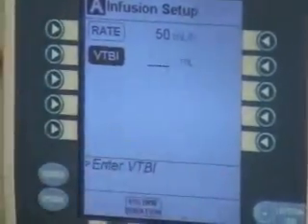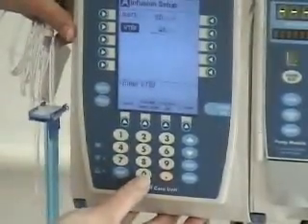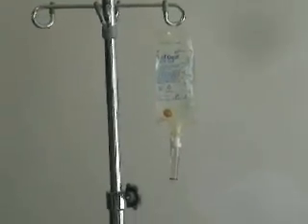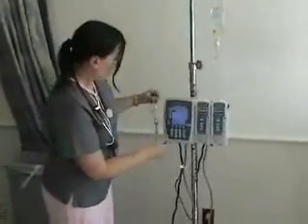It says how many milliliters, and we'll pick 400. By picking 400 out of a 500-milliliter bag, I know I'll get a beep when it gets down to 100 milliliters — it gives me time to run to the med room, get another IV, and hang it.